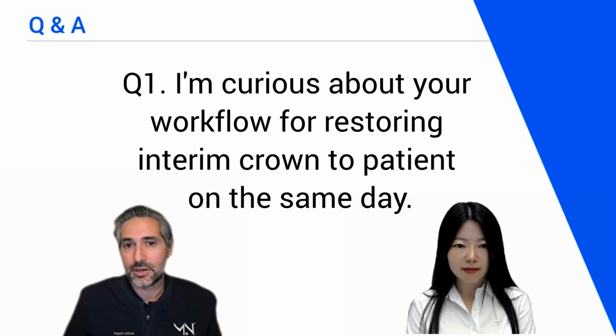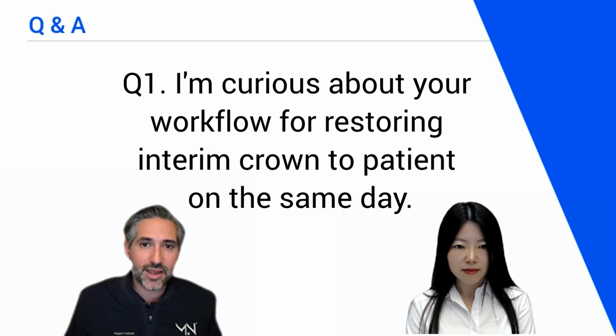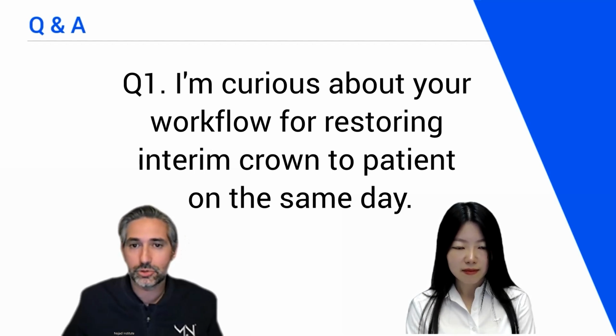So because of that reason, using bisacryl and a high quality putty or a really good pre-op impression, I can make the provisional in maximum 5 minutes. Sometimes with a crown 5-6 minutes, with an inlay onlay, something partial coverage, it's probably 3 or 4 minutes and adjust occlusion. That's it. So I usually don't want to 3D print those.